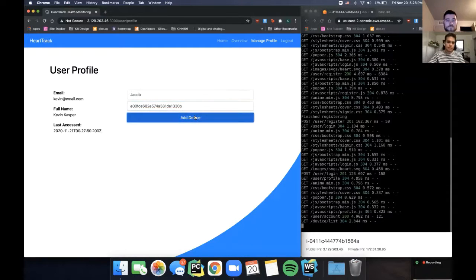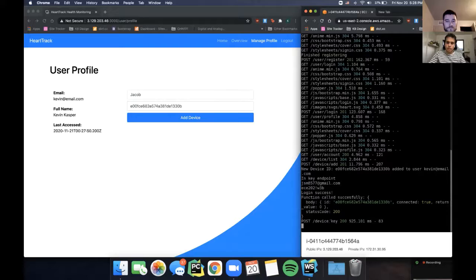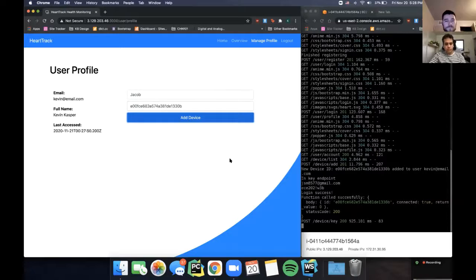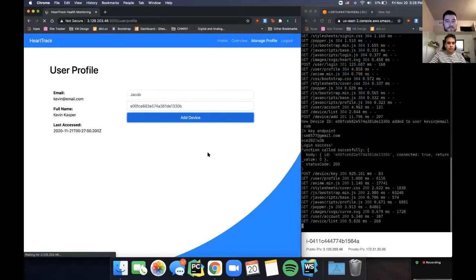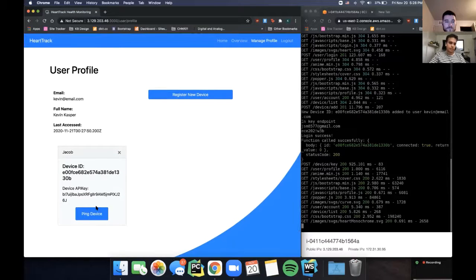So we can hit Add Device, and you can see that we have connected to Particle servers, and we have properly connected to the device. So if we refresh the page, you'll be able to see the new device. It also displays the API key and the option to ping it. So if you have multiple devices, you can know exactly which one that you're speaking with.